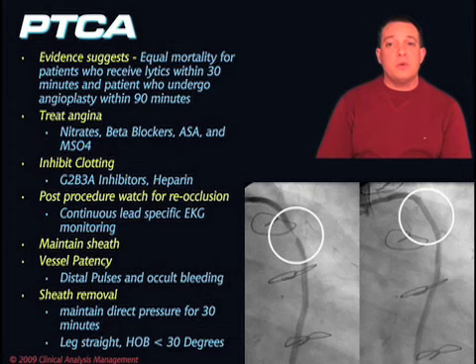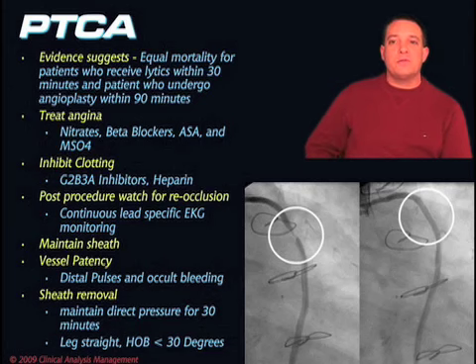And if the sheath has been removed, remember there's two big things we want to know. The first thing we want to know is how long do we have to maintain direct pressure? And it very much depends on the type of sheath. So this is something that the cath lab nurses should be able to tell you. Some of the sheaths you have to hold direct pressure for 30 minutes, some it's less, some it's more. So we want to know with this particular sheath, how long do we need to hold direct pressure on the leg?